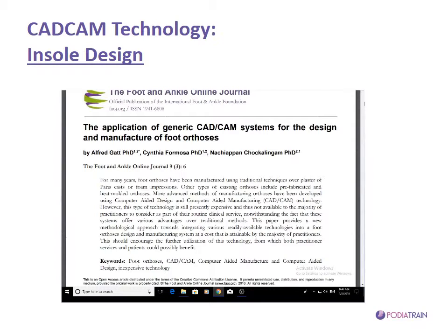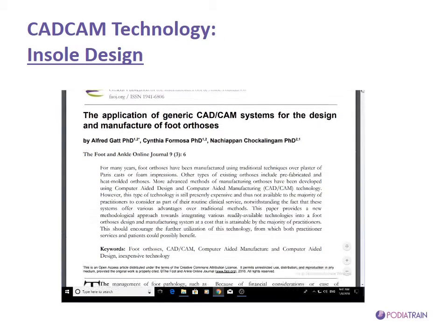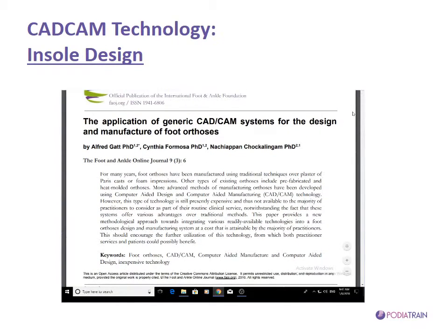So we have talked about CAD/CAM systems, and we have seen examples using custom design systems. Normally a podiatrist would revert to buying a system that is customized for making insoles or orthoses. However, one has to bear in mind that anything can be designed and manufactured using these systems. So any system that, even though it is made for orthosis, utilizes as an engine, as a software, a CAD and a CAM system.